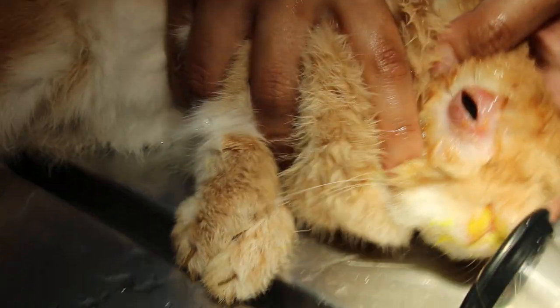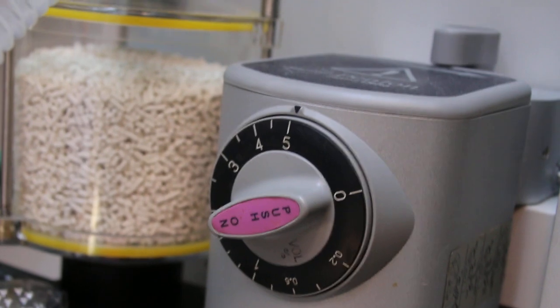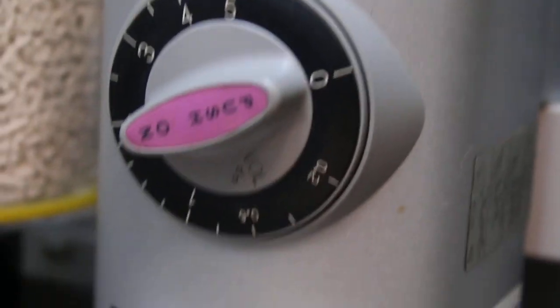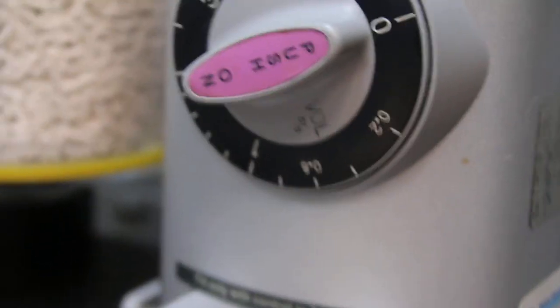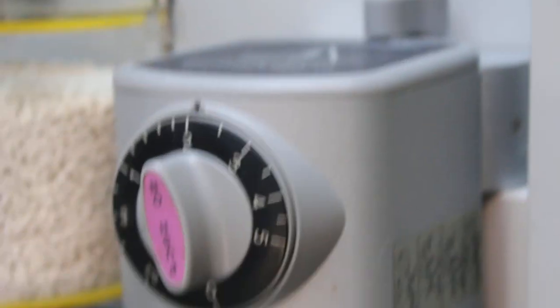We give some gas first. I will increase to 5% but for a very short while — just a few seconds. This is to effect, that's why you can't have a fixed formula. So I reduce back to 2.